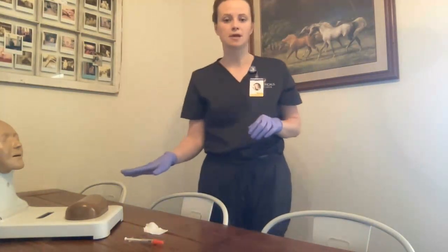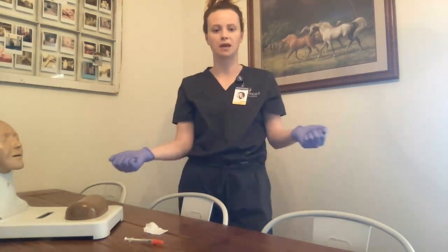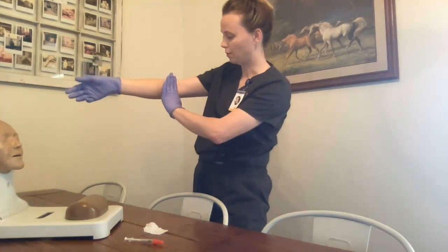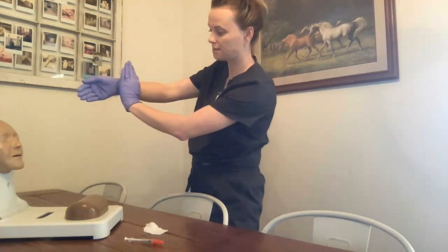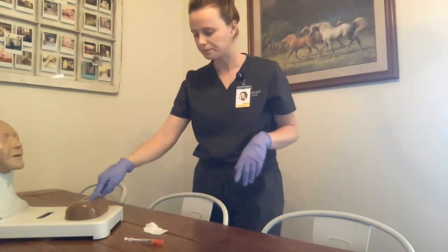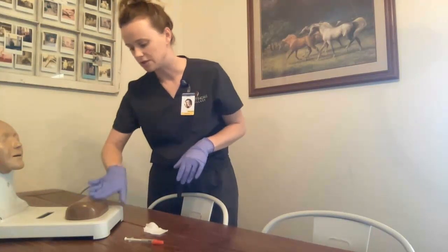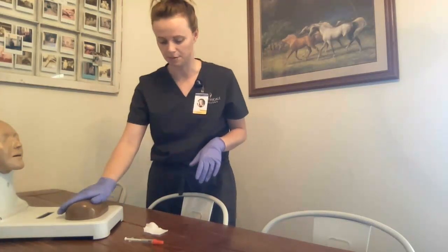Next, I'm going to select the appropriate site for an intradermal injection. Typically you would use either forearm; if that's not the case, you can use the upper back area. The proper location — typically three or four inches below the antecubital space, and then one hand-width above the wrist, so right in the middle of the arm — which would be right here on my patient. After selecting the site, I would assess it, making sure there aren't any lesions or discoloration. I would gently palpate to assess for any tenderness. This site is acceptable for use.